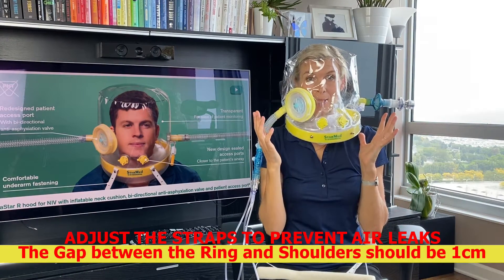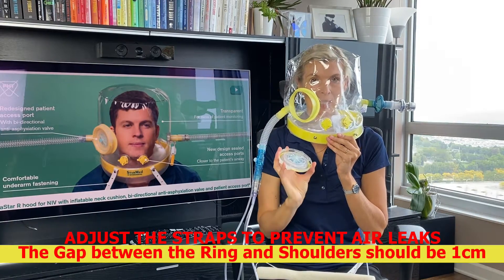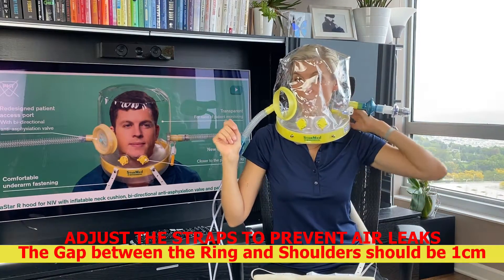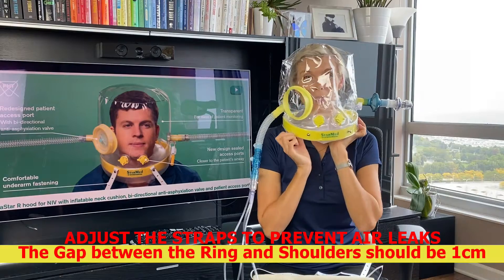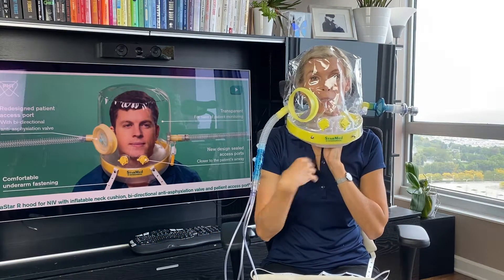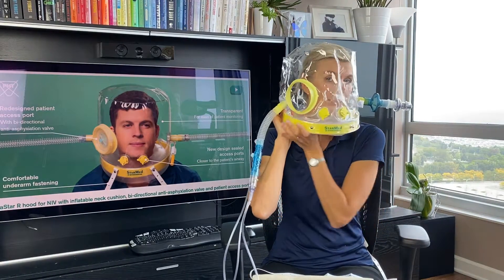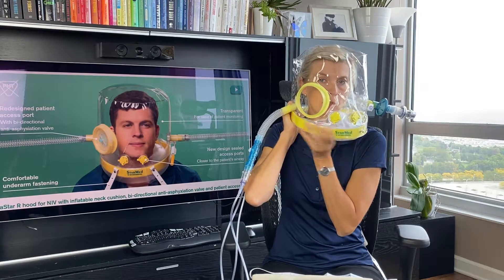When you take the helmet off, you do the same thing in reverse. First, take the valve off. Make sure you release the air from the cushion — the pillow that was inflated during therapy. Then, two people will stretch the neck seal nicely on both sides and take the helmet off the patient.